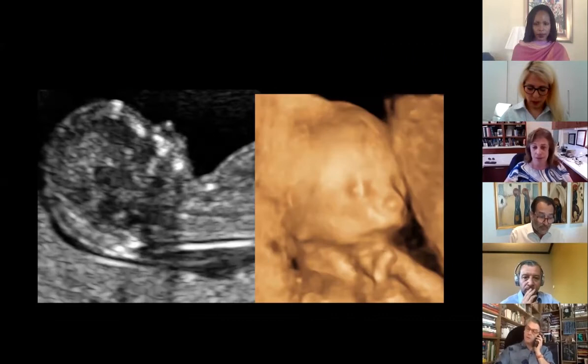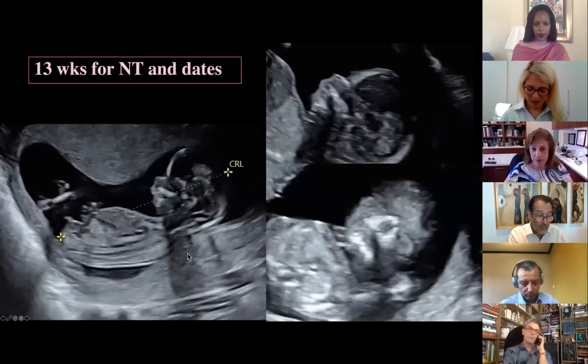And sometimes the chin is practically non-existent, as you can see here, where there's just a total missing portion of the mandible. So you can see very easily on this early fetus that the mandible is very small.